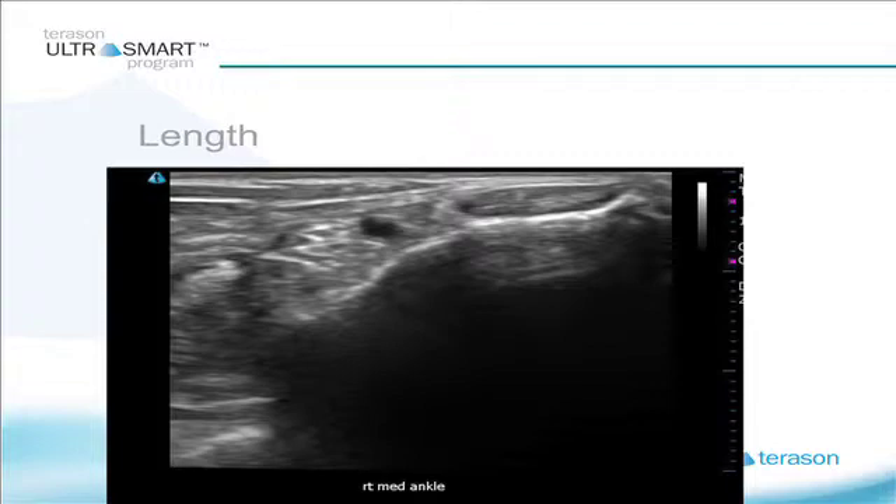Each one of these large hash marks on the side of the screen is one centimeter depth — so that's one, two, three centimeters down to the bottom of the screen. This is the tibialis posterior here. If I wanted to inject just underneath the flexor retinaculum, which is sitting right here, I would probably need about an inch and a quarter needle — I could use a 27 gauge inch and a quarter to achieve that. But if I wanted to get my needle down to the muscle belly of the flexor hallucis longus, which is sitting right down here, I'm going to need something longer to come all the way down into this tissue. And then depending on which direction I'm going to go in.